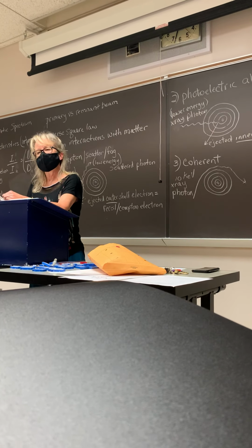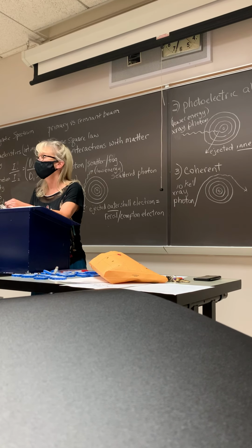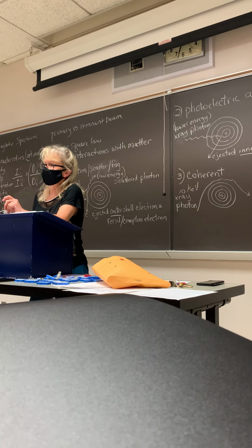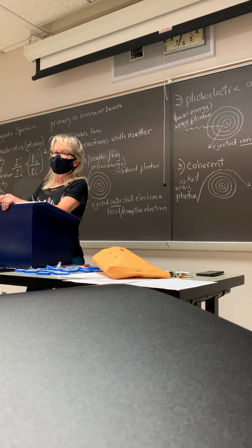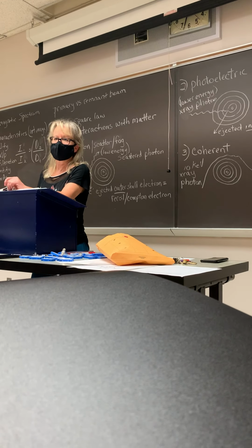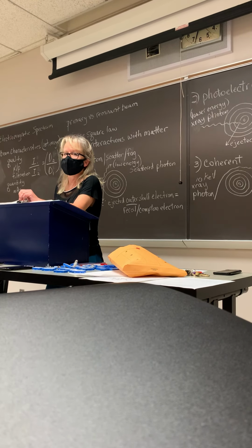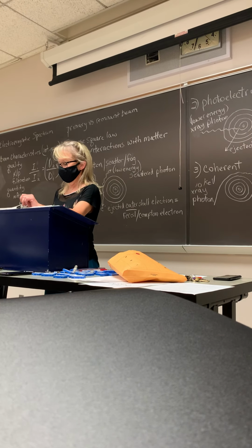When they fluoro, what's the mA that's being used? Good, good. mA in fluoro is between 1 to 5. That's it. mA, when you shoot a conventional x-ray, when you shoot a regular x-ray, it's in the hundreds. Most machines go to like 1,000. So why is there so much dose when you fluoro? Good, because of the time you're standing on that fluoro switch. All right.